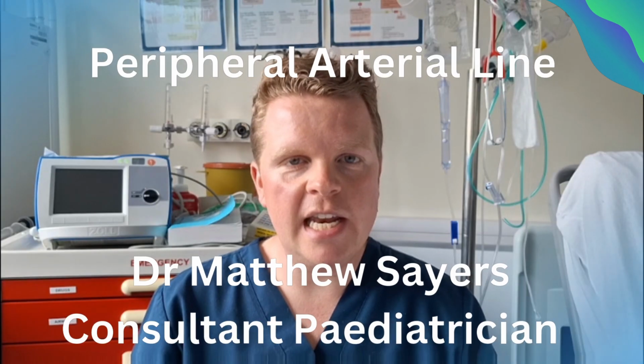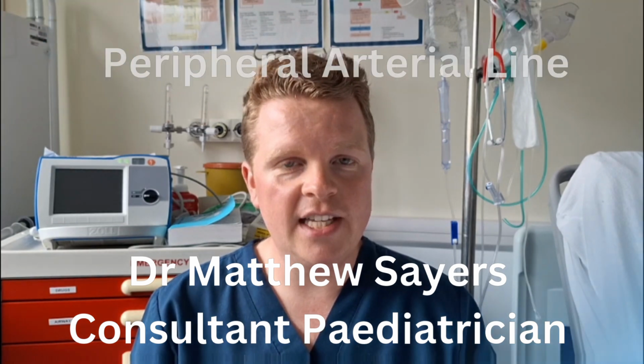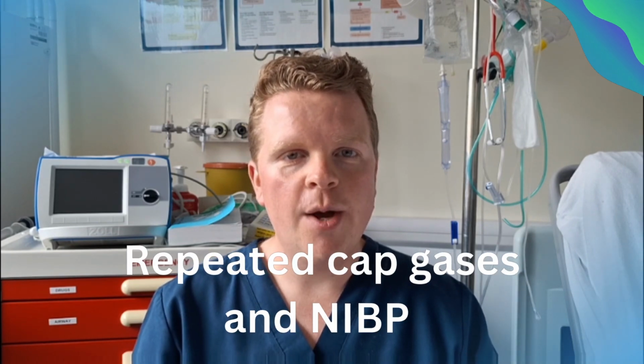You ever had a baby in the neonatal unit that no matter how hard you try, you just can't insert a UAC? You have two options. You could either perform repeated frequent capillary blood gas monitoring and non-invasive blood pressure monitoring, but this is not ideal in a critically unwell neonate.